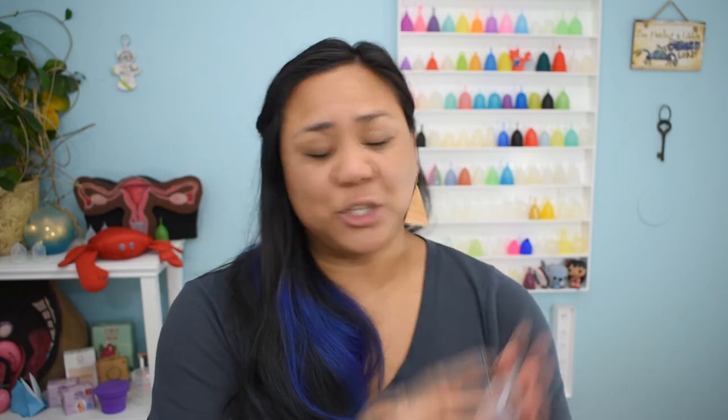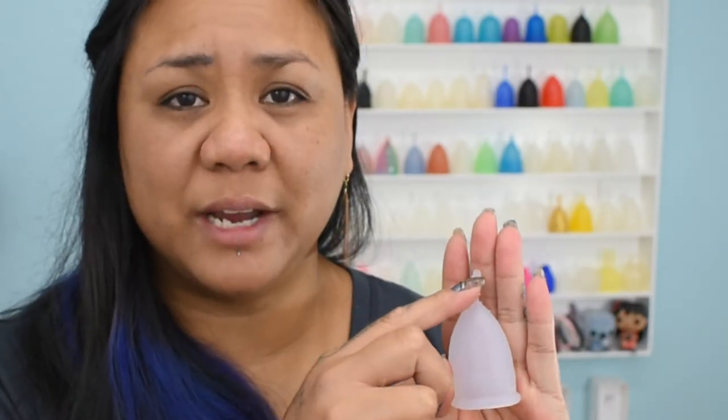Once I got the cup inserted it felt comfortable — I didn't detect it and the rim didn't press on anything sensitive. The one area I didn't care for was the stem. In my unboxing video I mentioned the stem was nice and flexible and the grip rings shifted under my fingers, so I thought it would be fine, but when I was actually wearing it, it did give me some irritation.